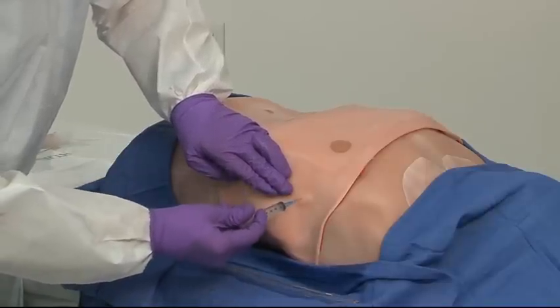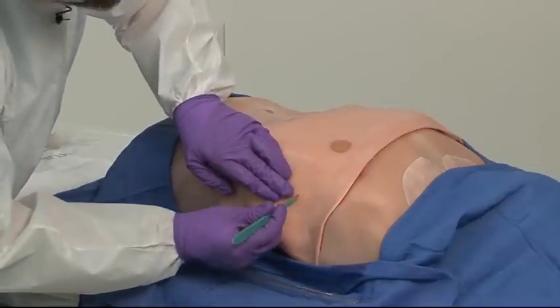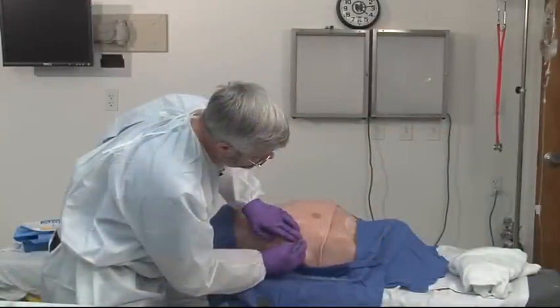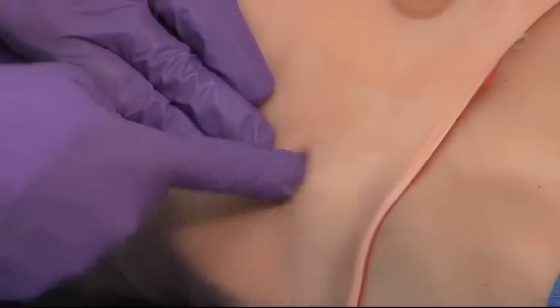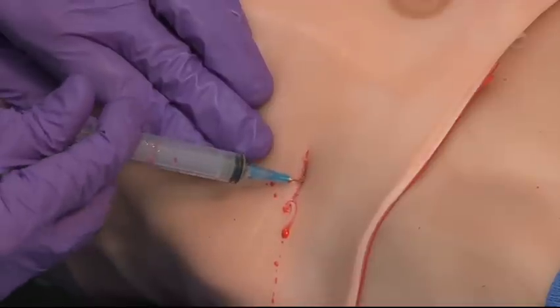I usually like to go down right on top of the rib that I'm going to be making my incision over. I'm then going to take a 10 blade, make an incision approximately 2 to 2.5 centimeters in length over the rib, right down onto that rib. Now, what I like to do is actually verify I'm on top of that rib. I can feel that rib underneath my finger here. I'm then going to take my anesthesia and infiltrate a little bit more anesthesia on top of the rib.